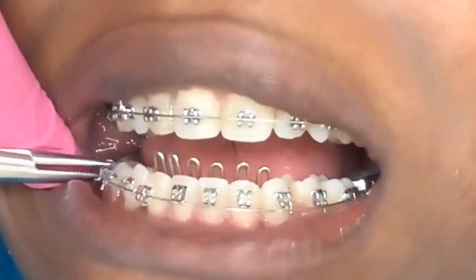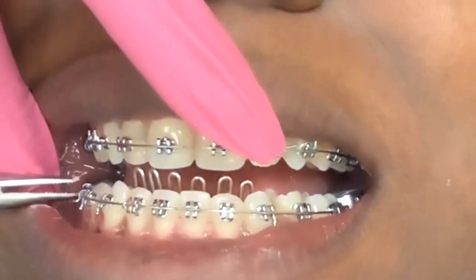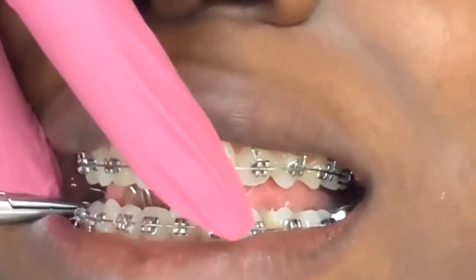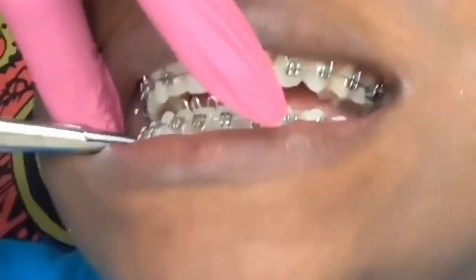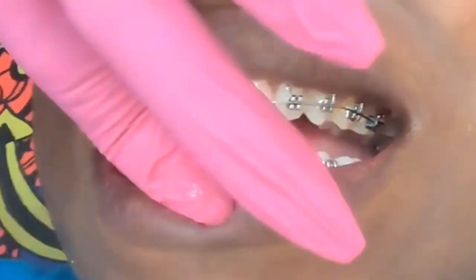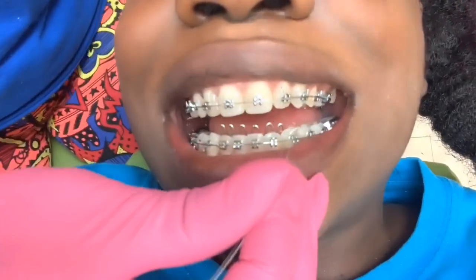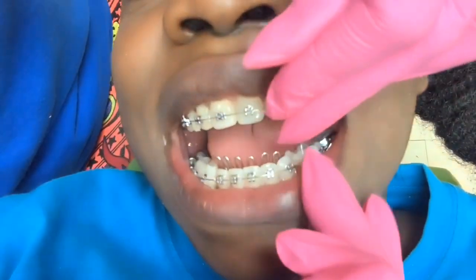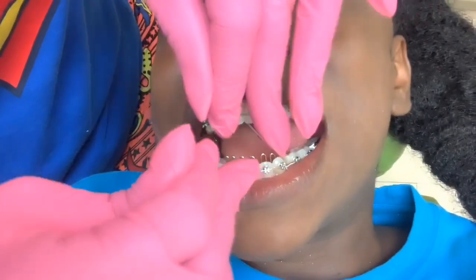Because after this, she goes ahead and puts the ligature ties, and the ligature ties are really tight and they tie all of the teeth together, and you will see that in a few. Okay, here we go. She's putting on the ligature ties, and as you can see, she's just connecting all the brackets together. Doing this really tightly.